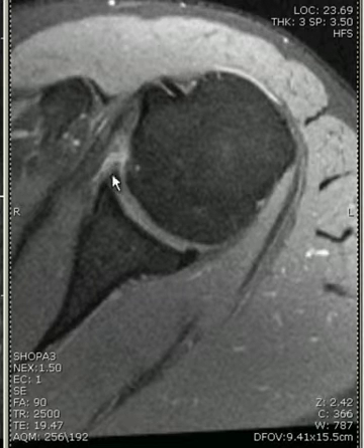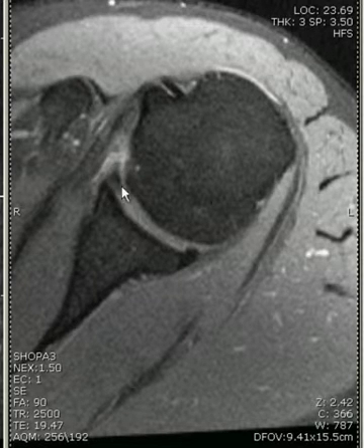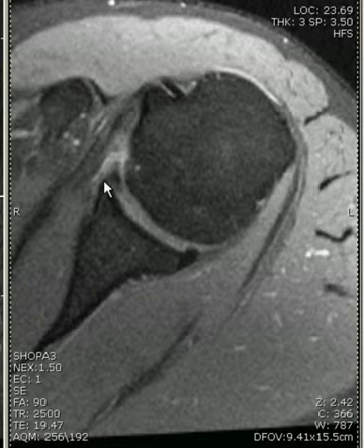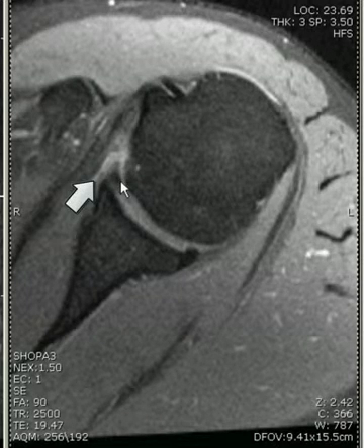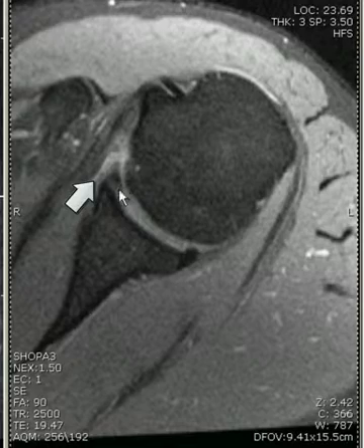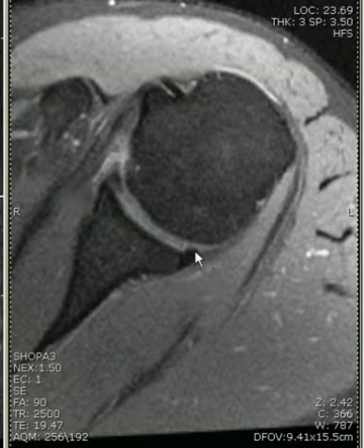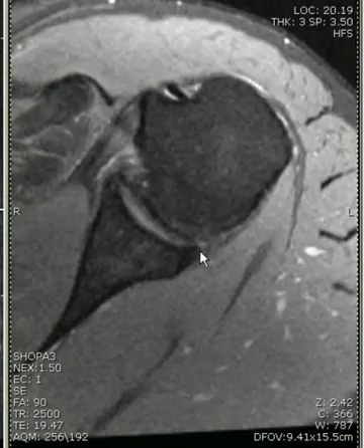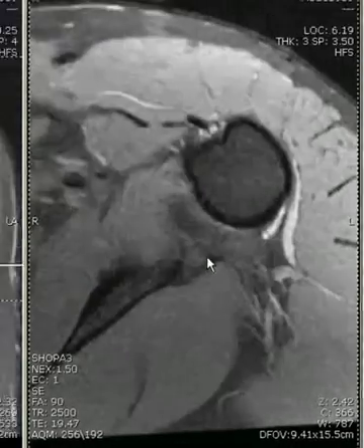Somewhat more inferiorly, we can see the low signal intensity triangles representing the anterior and posterior portions of the labrum, which are normal.